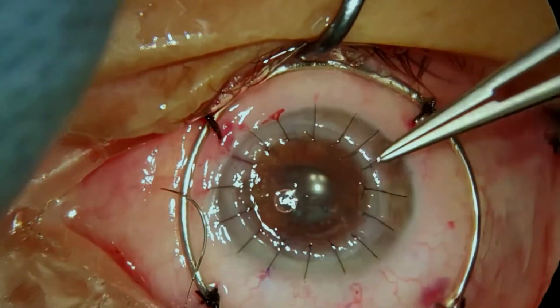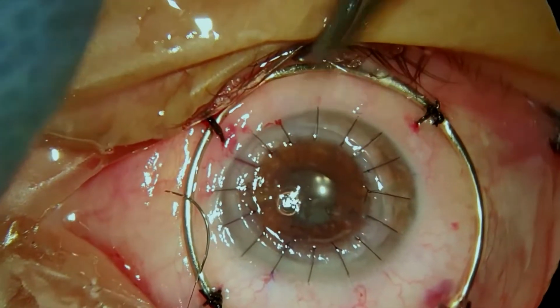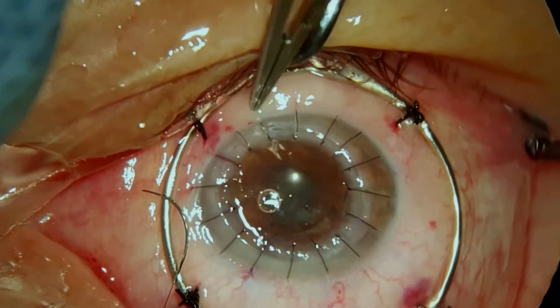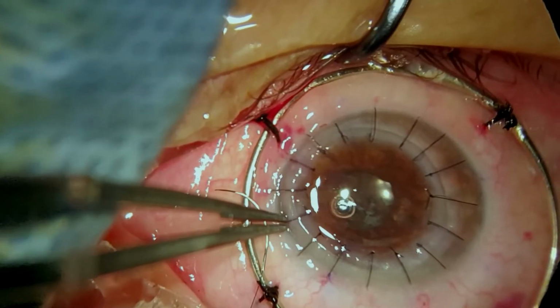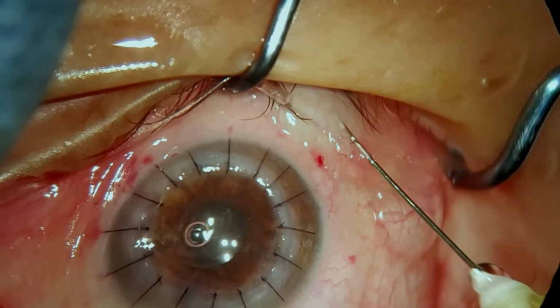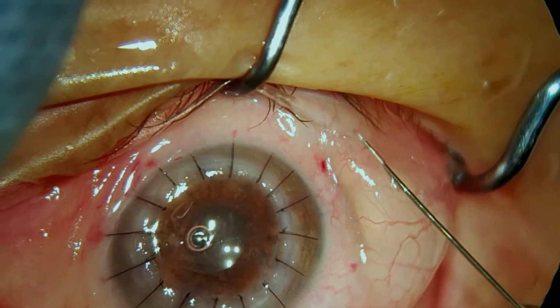Here you can see us burying the knots. We routinely bury them in the donor cornea. Sometimes they won't go in, and we rotate them the other way. But at the end, they should always be in the donor graft. Subconjunctival dexamethasone, and that's the case.